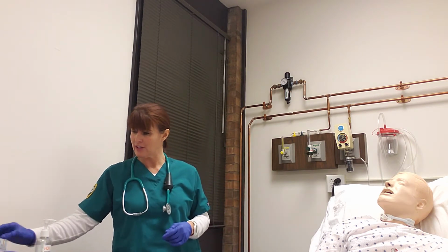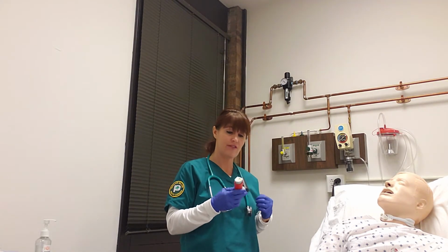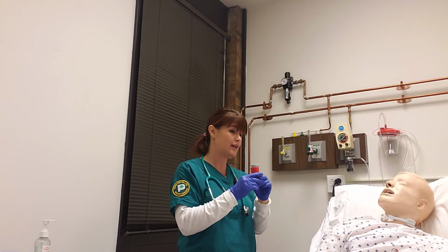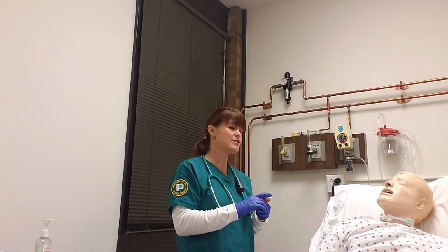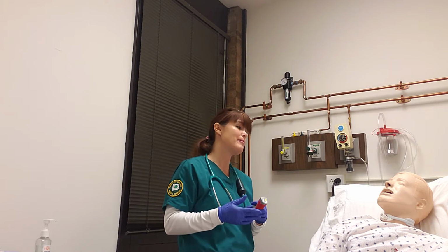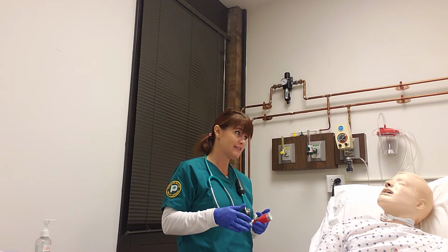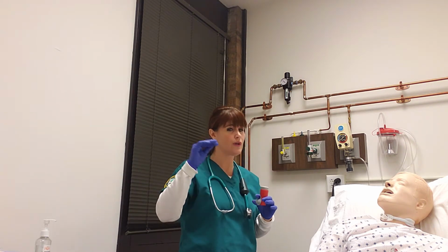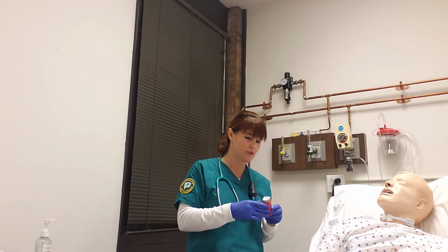All righty, so now we're getting on to the doctor's medicine that he's prescribed. Okay, this is Symbicort. This is not a fast-acting inhaler. If you start feeling all wheezy and have an asthma attack, this is not the medicine to use, okay? It's not going to help you at all. In fact, this could actually give you bronchospasms. I don't want you to be concerned if you do. I mean, it's the type of medicine, it can do it. But what I really need you to do is wait about 5 to 10 minutes before you use your albuterol. Give this medicine time to work, get things going, and then use your albuterol, all right? But don't be concerned. It's just the way this one seems to work.